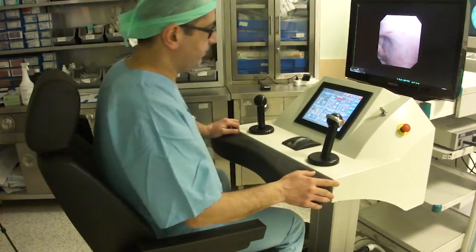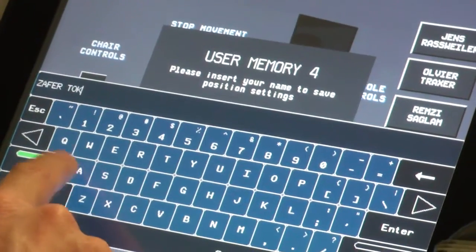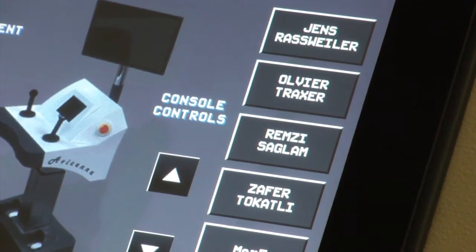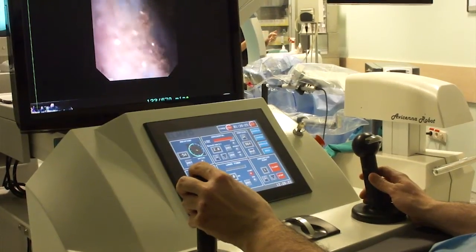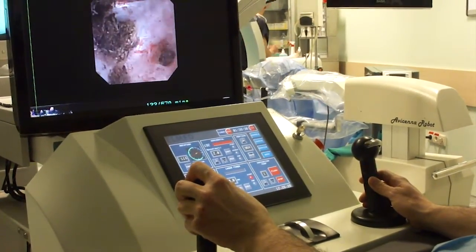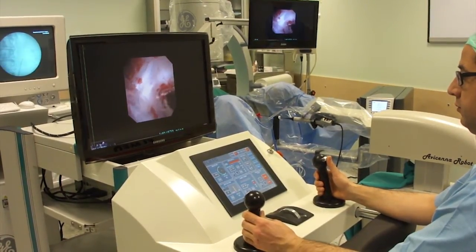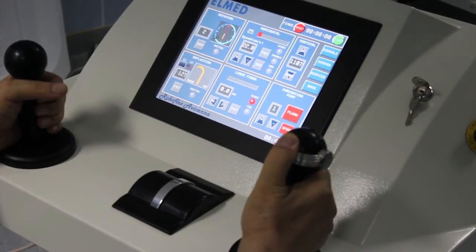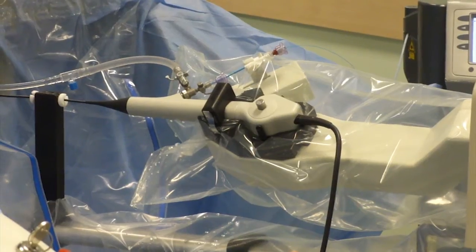The surgeon then sits at the console. The position of the ergonomic chair, armrest, and control panel can be individually adjusted and stored in the system for up to six users. To manipulate the endoscope, the surgeon controls two joysticks. The right joystick enables deflection and is designed similar to the handpiece of any standard flexible ureteroscope, with micromotors moving the steering lever of the handpiece.